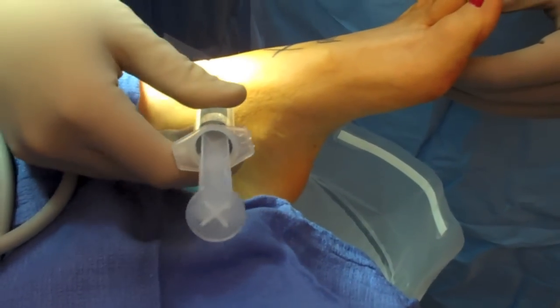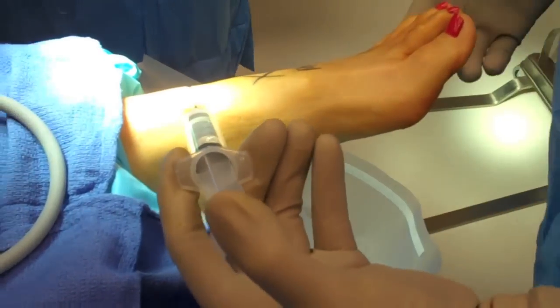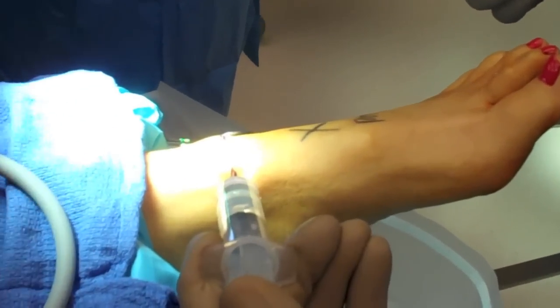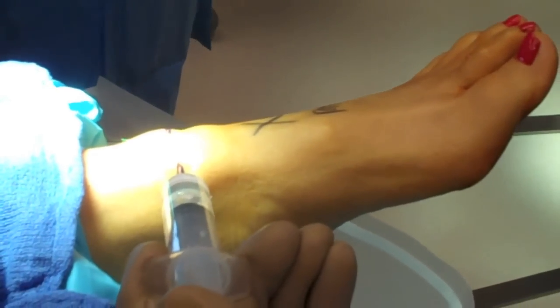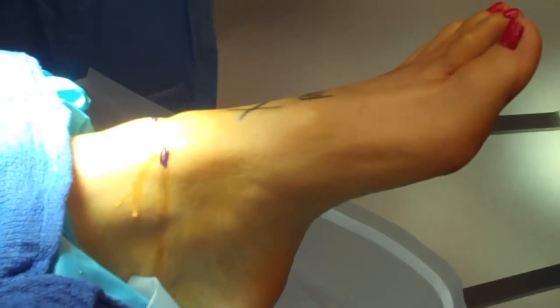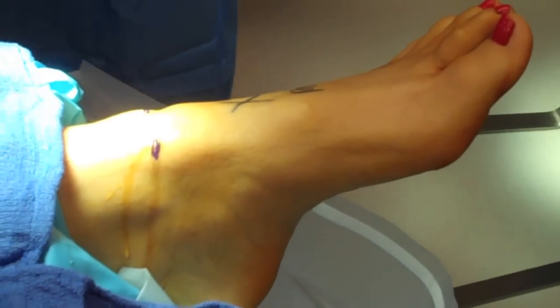The ankle joint is then distended from the anterior medial portal with 20 cc's of lactated ringers. You should see the ankle joint dorsiflex and you should only inject to a firm resistance. You do not want to blow out the lateral aspect of the ankle joint capsule.